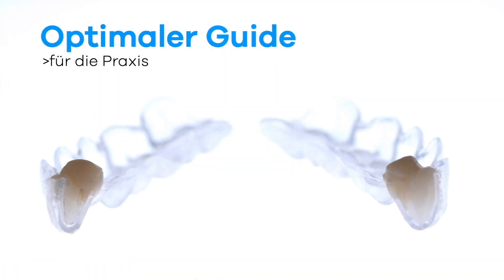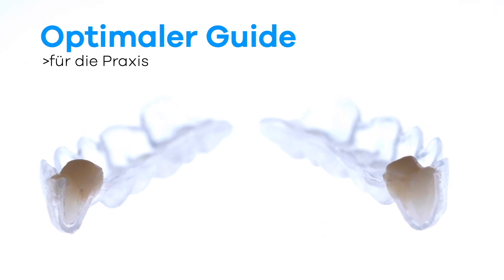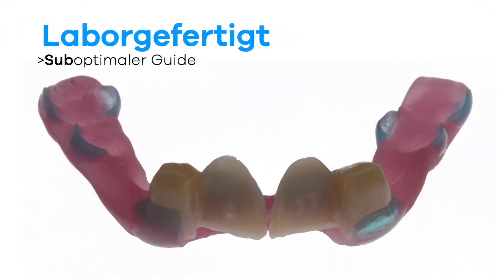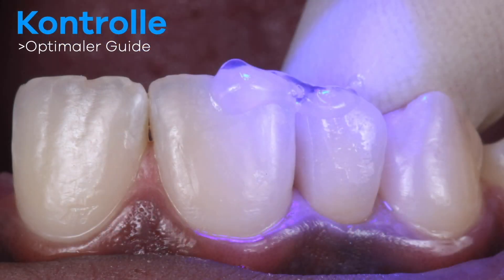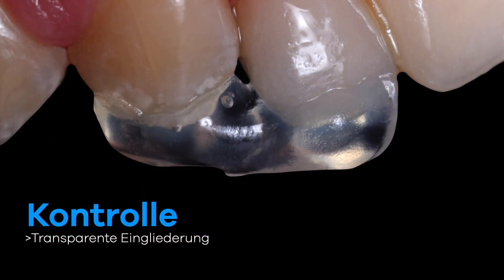Another tip is that wearing the Duran splint can lead to minimal movement of the neighboring teeth. This means that a fastening guide prepared in advance can show deviations. For this reason, we use a transparent, light-curing composite, which gives us better control over the integration.